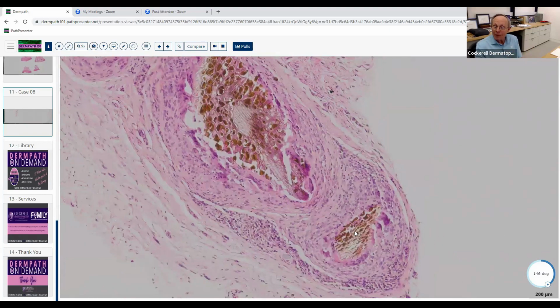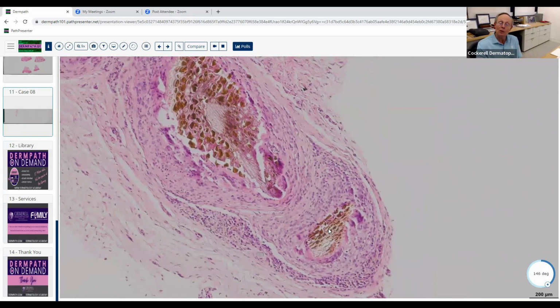Patient probably complaining of a persistent nodule. It wasn't growing or anything like that. But if you saw the hyphae, would you say the patient truly has an infection or no? No. We see that all the time, and it's just basically the hyphae may have already been growing inside the splinter when it got introduced into the patient, because in the real world, these hyphae are growing inside plants and the bark of trees all the time. If you were to take a piece of bark off a tree and look at it in the microscope, you might see hyphal elements in there. And it doesn't mean that if that got introduced into the patient they're going to actually get an infection from it. Now, if they're immunocompromised, they might.